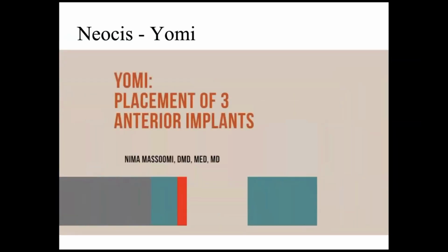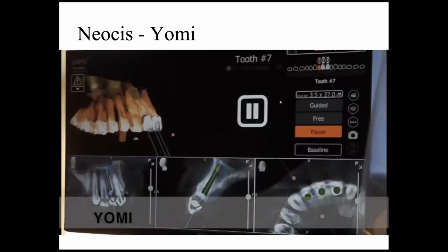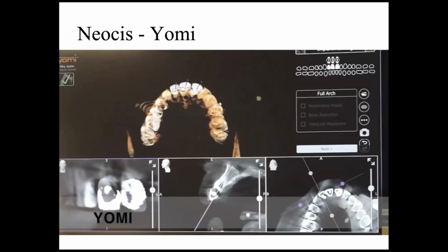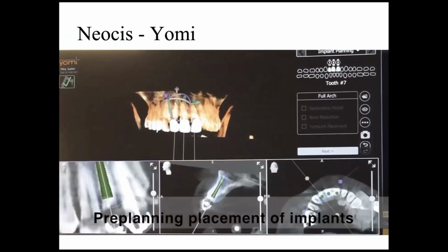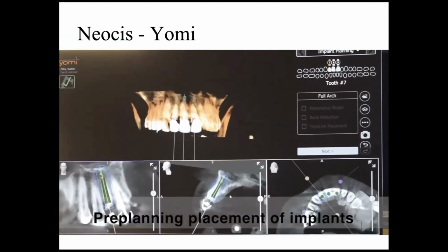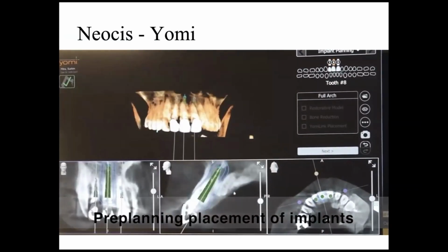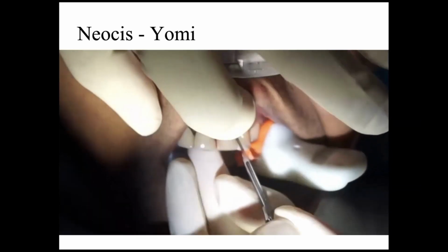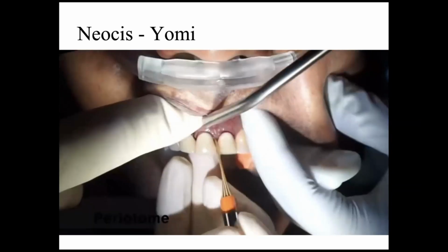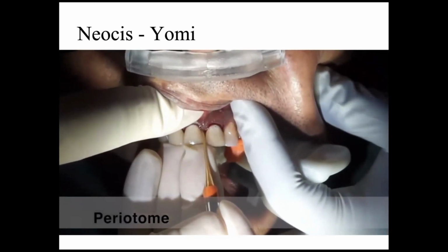Okay, so I'm going to show you this. We just did this two weeks ago, where we did three anterior teeth on a guy who fell off a balcony when he was younger and had three fused crowns. You can see in the program here that I've tried to make the implants parallel to one another from a restorative standpoint, and in a screw-retained position. We always try to place them more palatally, so you can see in that middle window that we're able to get a screw-retained restoration for the restorative dentists. And then this is us taking the teeth out, and all three crowns are fused together at this point.